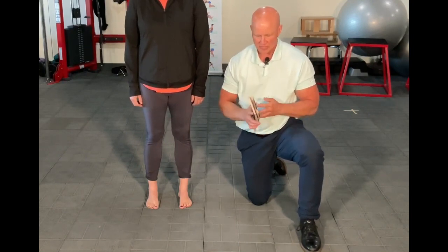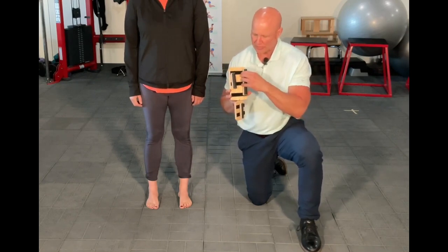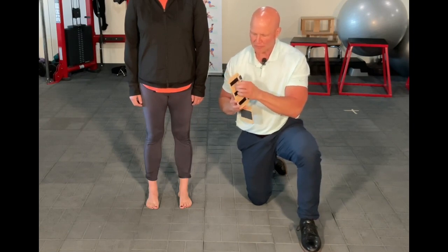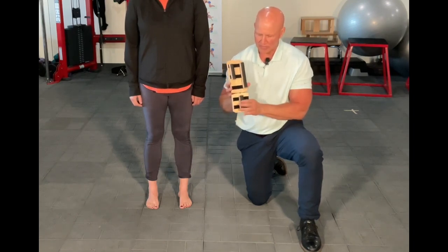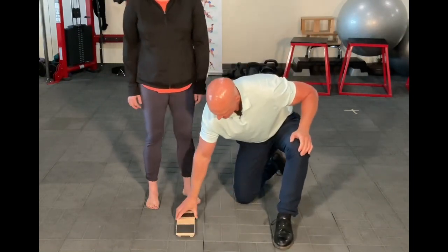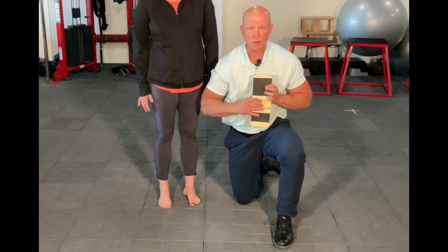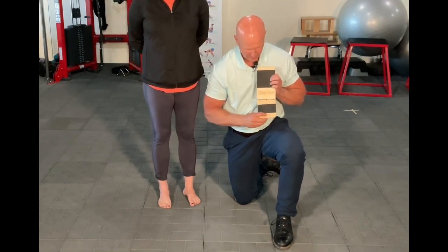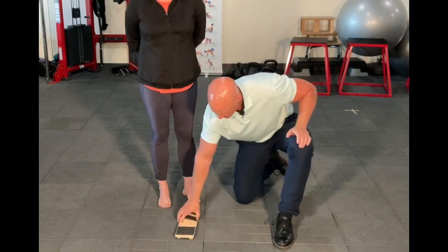So I've got Vanessa here, and how it's set up right now, you can see there's 3 little strips or boards that can be taken off and on the Velcro. The way it's set up now, the forefoot's not going to move and the hind foot is going to move. So I'm going to set this down, and there is also a line here and a line here, so you know to set up the center of your heel right in the middle and the center of your forefoot right in the center.